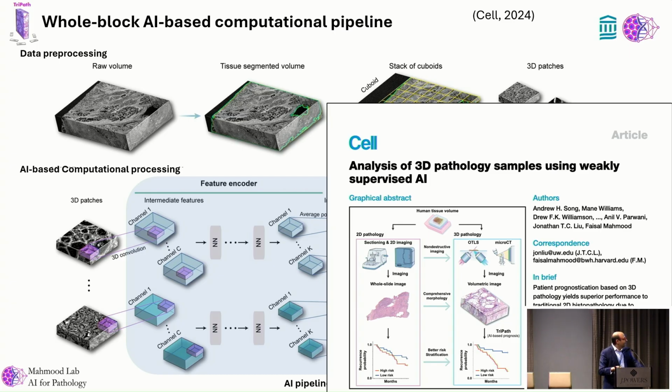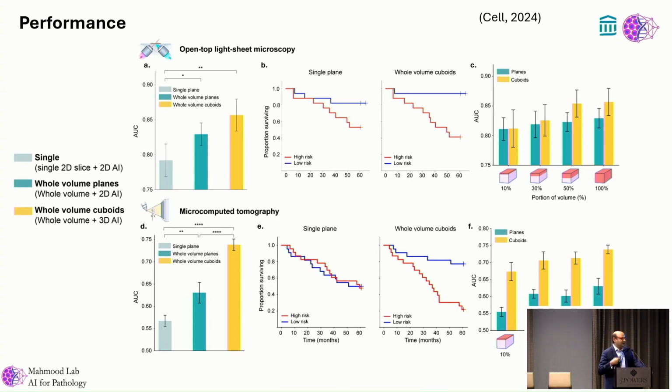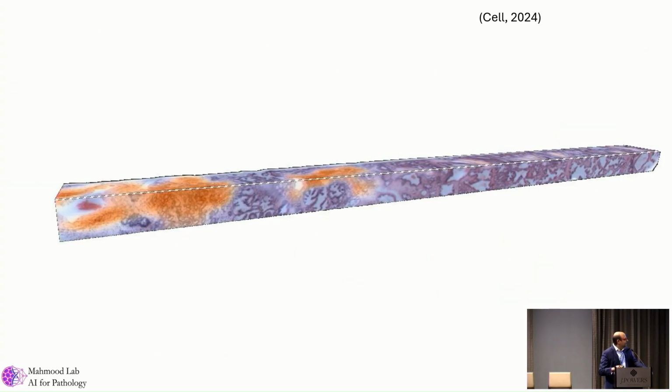And then once you have these models trained, you can look at how separable the patients are when you use the entire 3D volume rather than just using a 2D section or a multitude of 2D sections alone, whether that 3D morphology actually helps and benefits this, right? So this is a large part of this. And then you can, of course, look at the 3-dimensional heat maps.